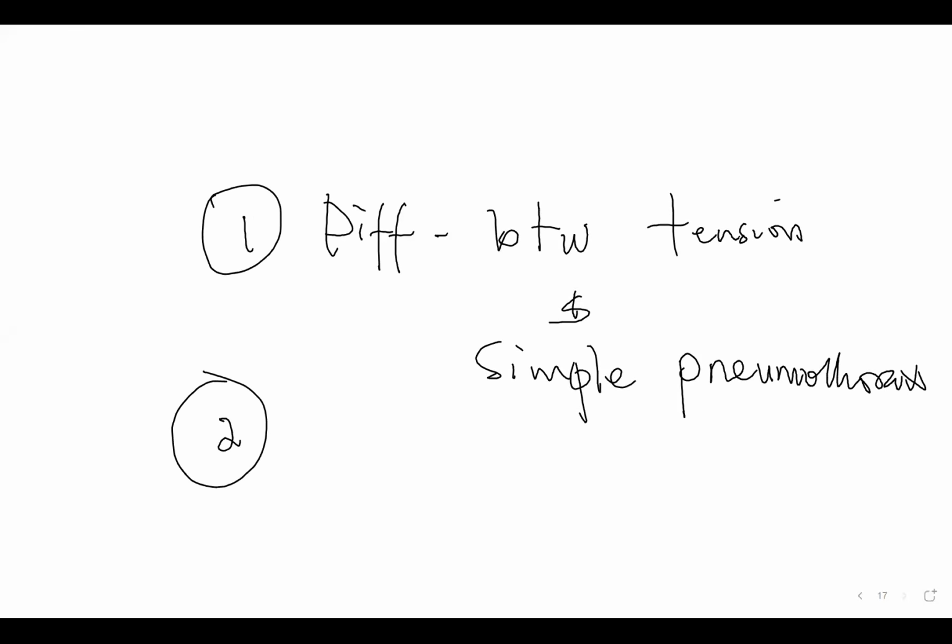Everybody's clear. I'll take a snapshot of our attendance before we leave. Before the snapshot, everybody must answer his name. Now, in tension pneumothorax, when you see an X-ray with a collapsed lung on the affected side, you see radiolucency. Then you look for three other features. One, there's mediastinal shift to the contralateral side. Two, there's widening of intercostal space. And three, there's depression of the diaphragm.